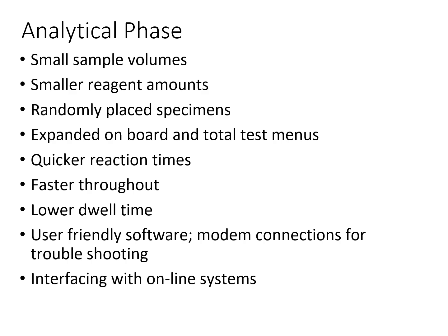So obviously some benefits of this is it has improved efficiency and cost effectiveness. It enhances the flexibility to handle a variety of test requests and better data management and quicker reporting for our patients.